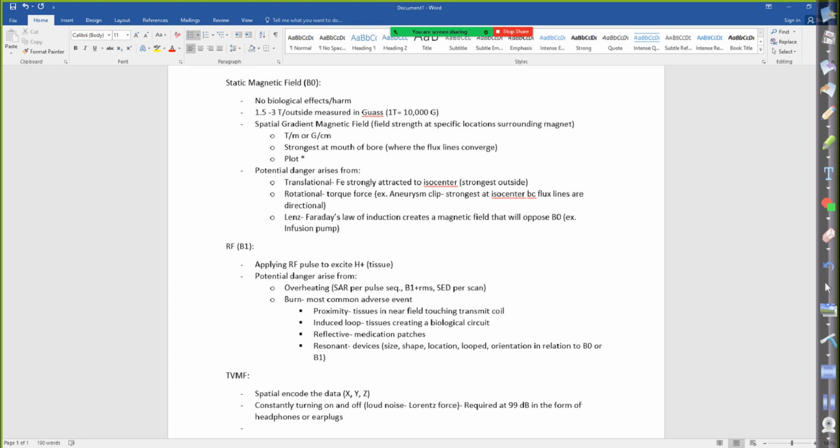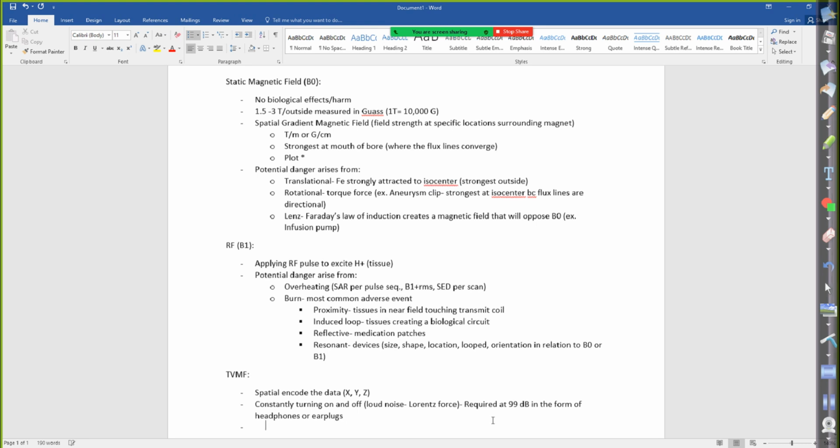If it is lower, maybe it averages in, and they can only reduce it more, I think. But that's a good question. You try to be loud enough so that the patient can enjoy it and hear it over the gradients, but the only time patients really hear it is in between sequences. I would do a little investigating and see if that's incorporated.